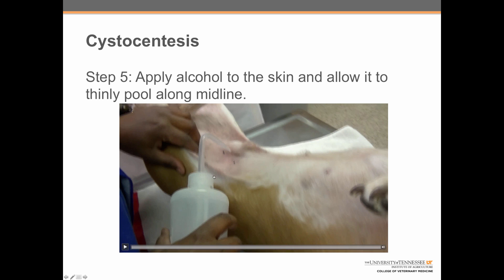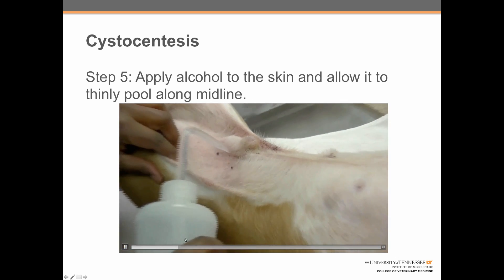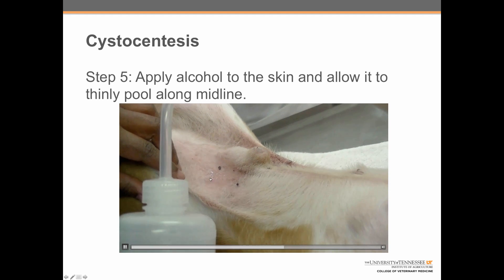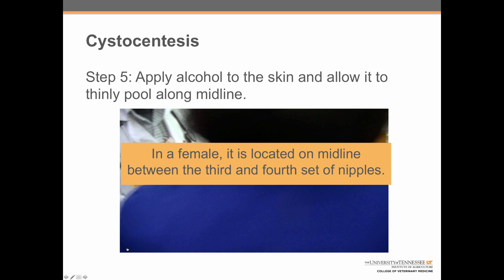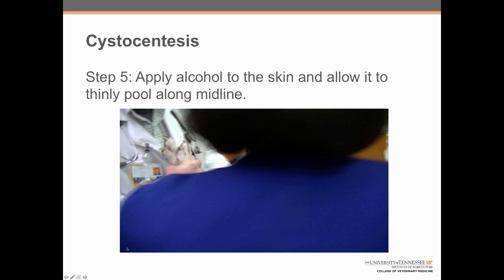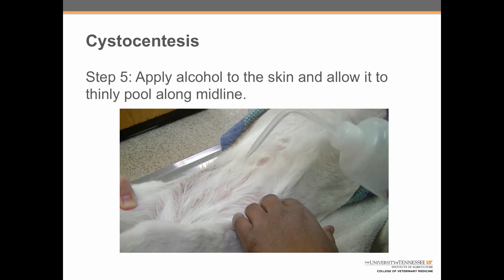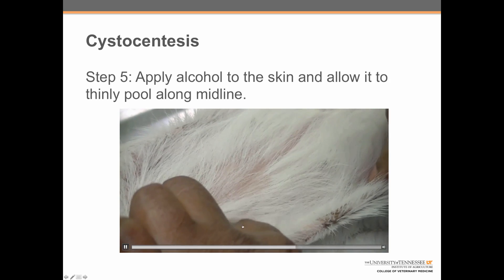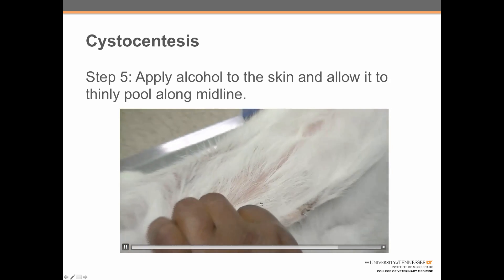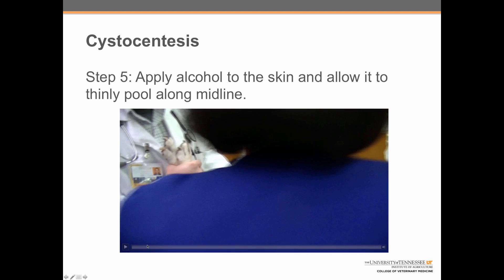Step five: apply alcohol to the skin and allow it to thinly pool on midline. In a male dog, this is generally slightly off of midline adjacent to the penis. Here is the penis and the alcohol is being allowed to pool just to the side of it. In a female dog, this location should be on midline between the third and fourth sets of nipples. Here we can see Shanna applying alcohol to the skin. She is checking the location of the third and fourth sets of nipples to make sure the alcohol is pooling where it should be. If too much tension is applied to the back legs, it can cause the alcohol to shift backwards towards the tail.